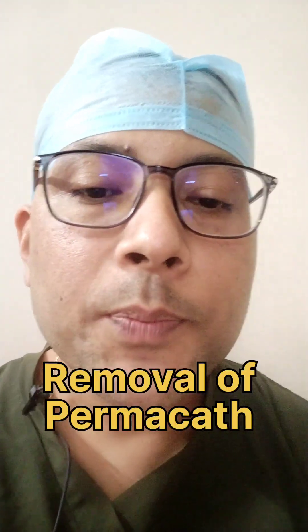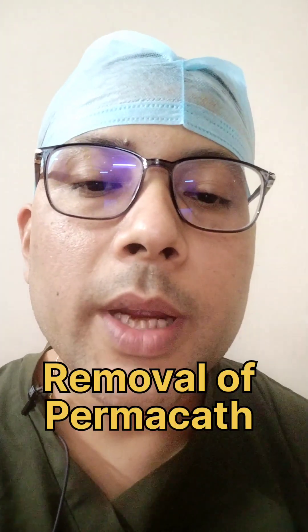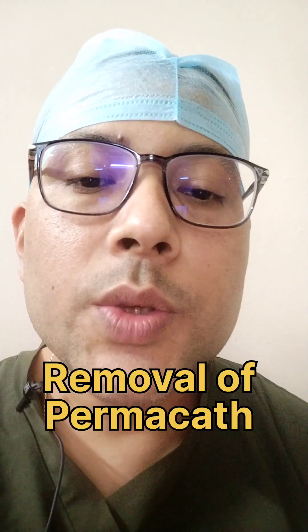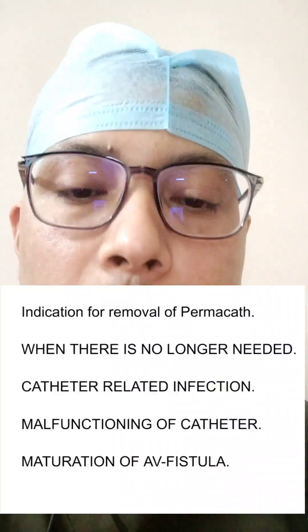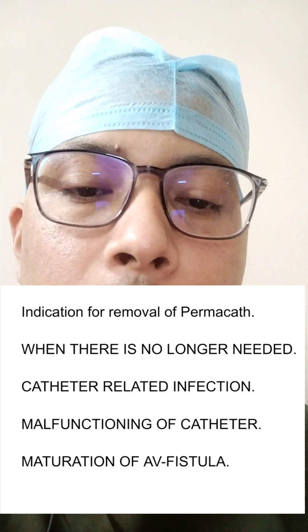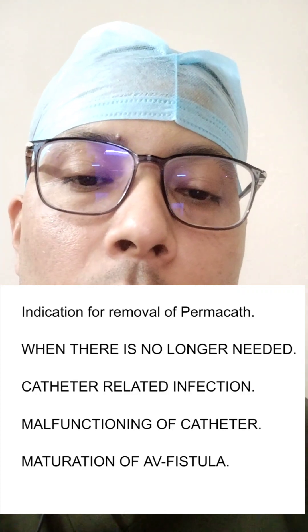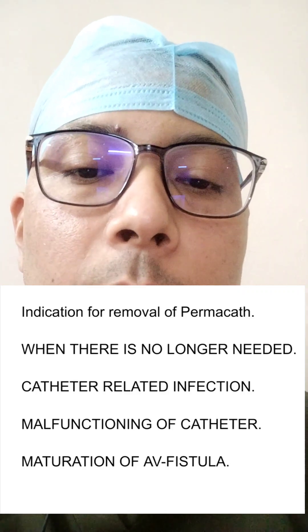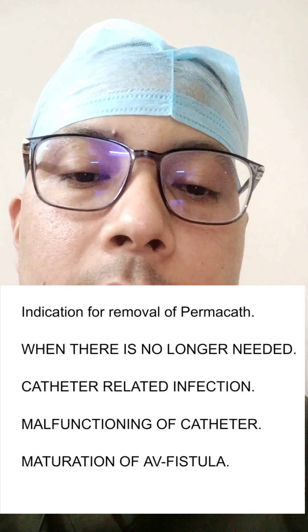In today's video we will see the removal of the PermaCath. The indication for removal of PermaCath is when there is no longer a need — for example, the maturation of a fistula, or catheter-related infection, or malfunctioning of the PermaCath.